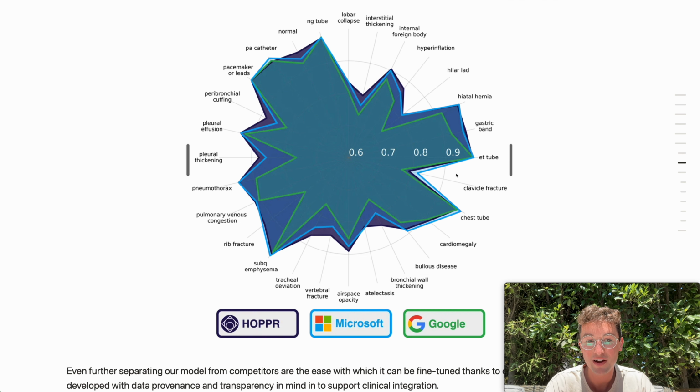And we can see here, it is not across the board, but these are some preliminary results that are all on fine-tuning jobs of each of these models that are comparable setups. And we do see, in many cases, in these initial preliminary results, the HOPPR Marie Curie Foundation model performing quite well, even outperforming, right?